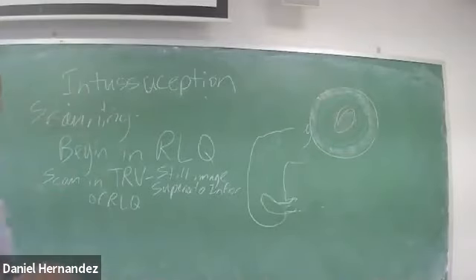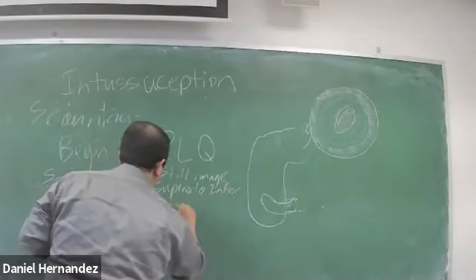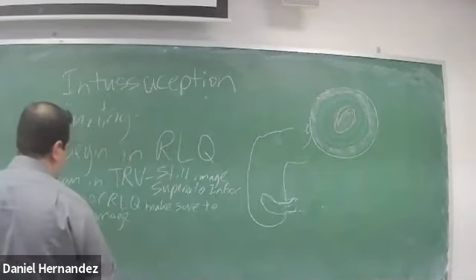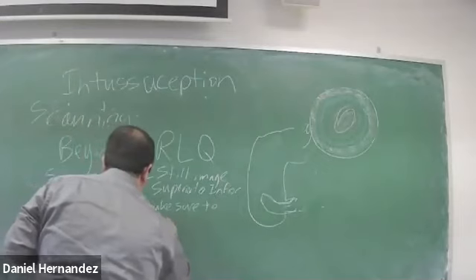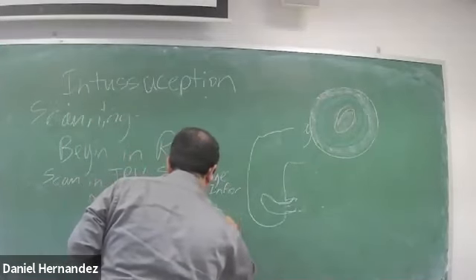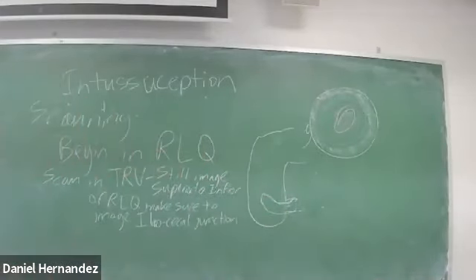So I'll do a series of still images, superior to inferior in the right lower quadrant, making sure I image the ileocecal junction. So I'm going to try and show that ileocecal junction in my images.